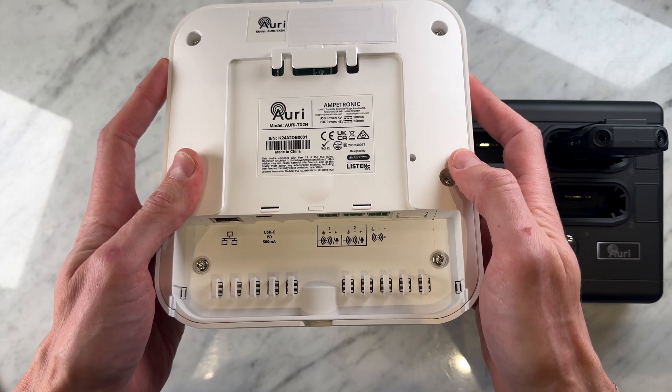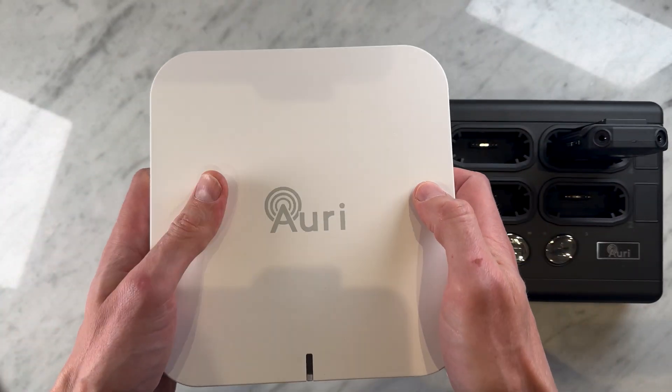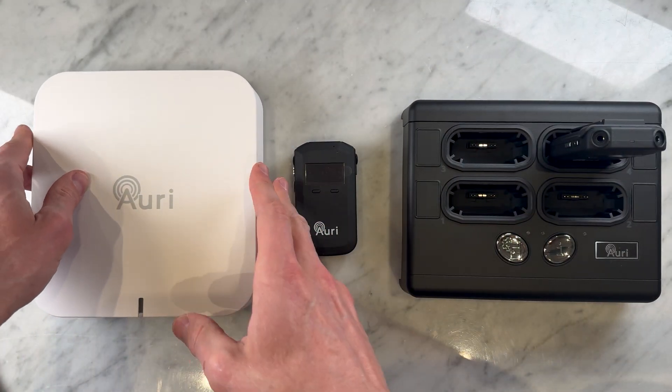It's also worth mentioning that as ReSound are ahead of the curve, they also have personal Auracost transmitters such as their TV streamer, allowing for the same features but just on an at-home level.